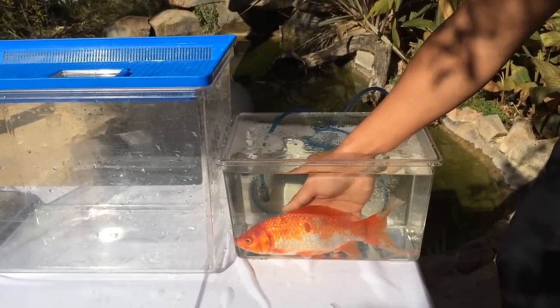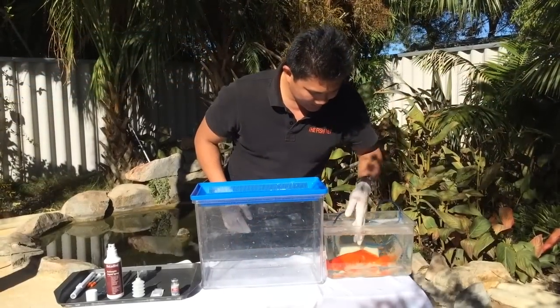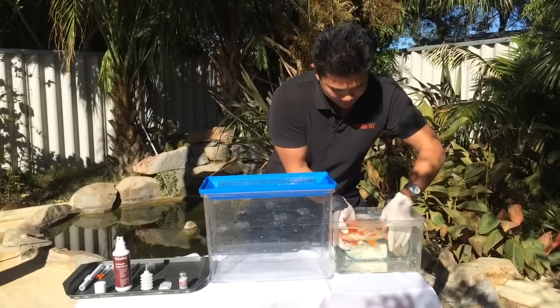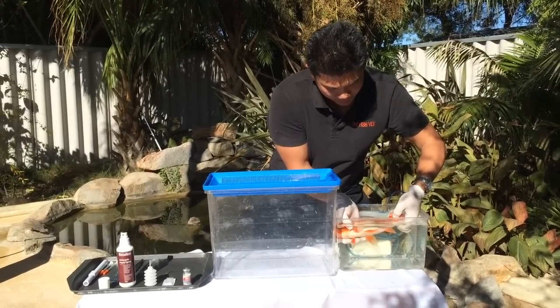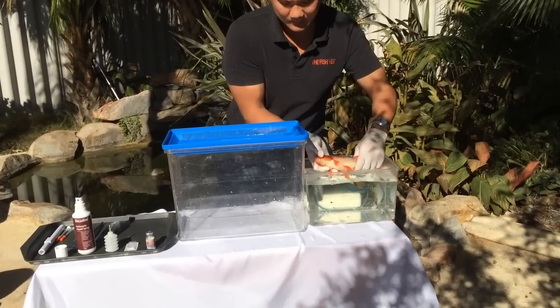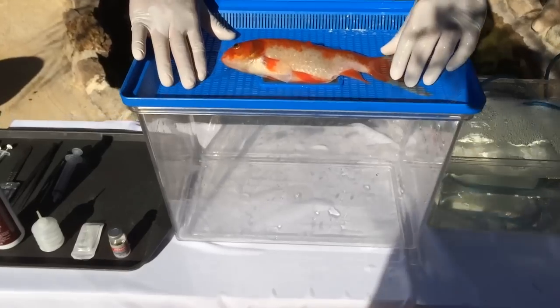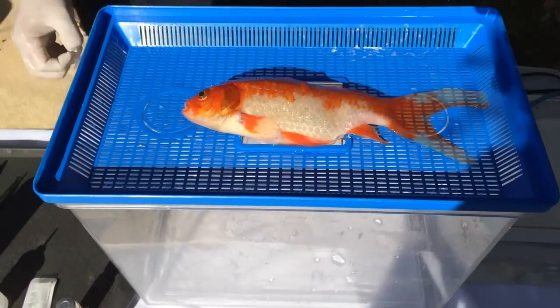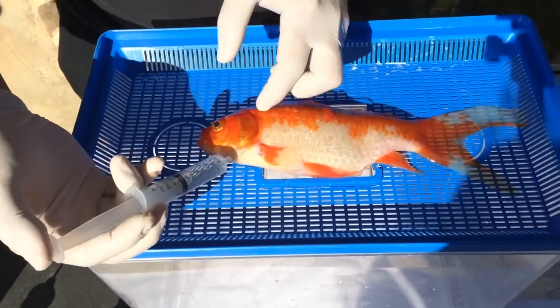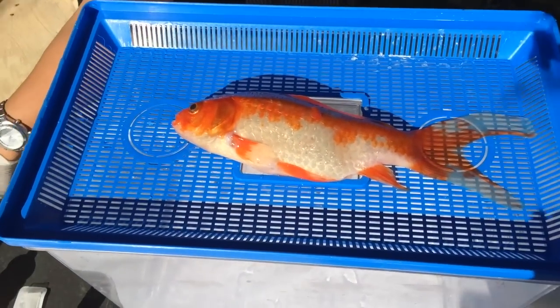But in this case I think we'll have a very good prognosis and achieve a cure by removing that lump. So here is Bruce — he's fully anesthetized now. Just to check: his gill movements have slowed down, and to check that he cannot detect pain, you squeeze the base of the tail fin and look for any evidence of movement. For the surgery table, what I normally use is just the top of the lid of an aquarium — it's really good because it can collect all the excess water when you're irrigating the gills or the fins.